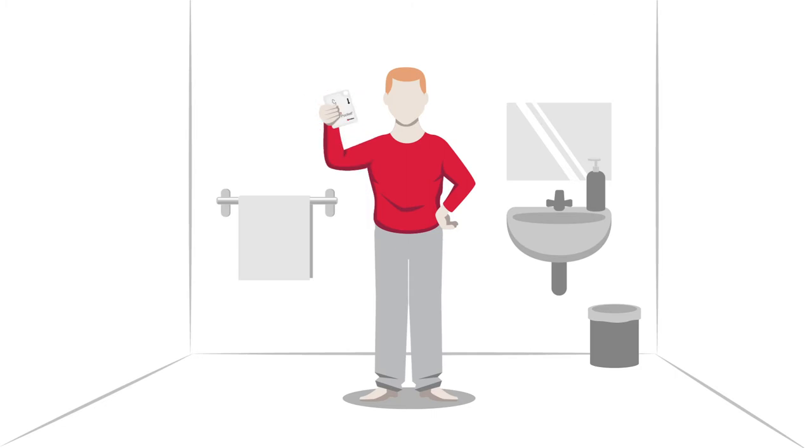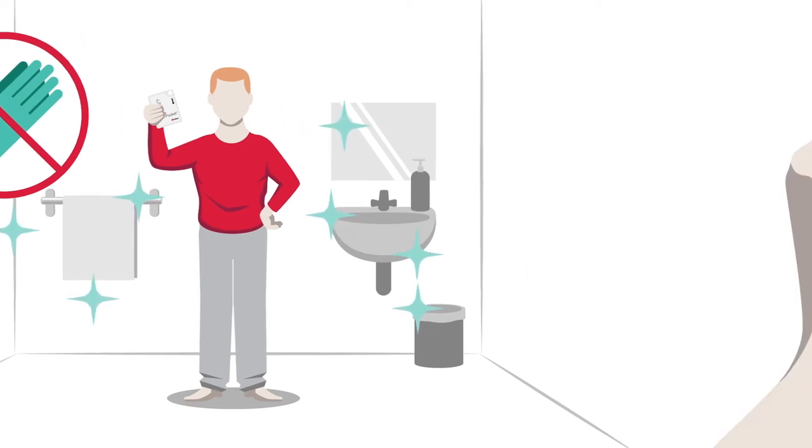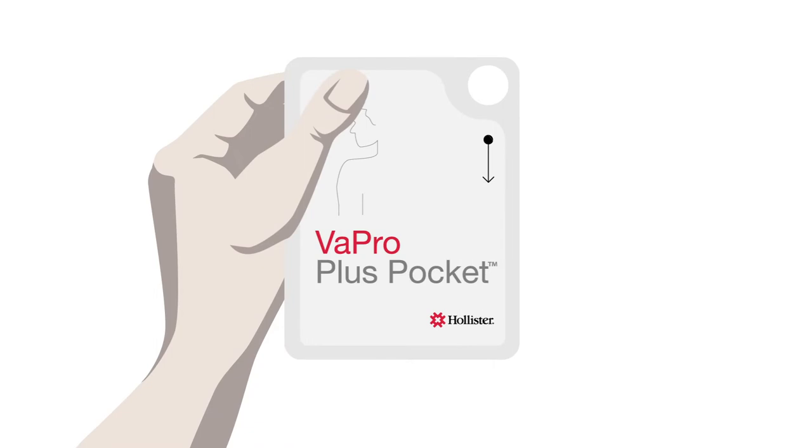We recommend that you perform this procedure in a clean environment. Please note, you do not need to wear gloves when using the VaPro Plus pocket catheter. After you have washed your hands, you can open the VaPro Plus pocket catheter package.